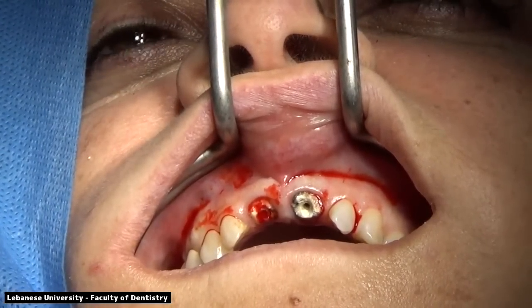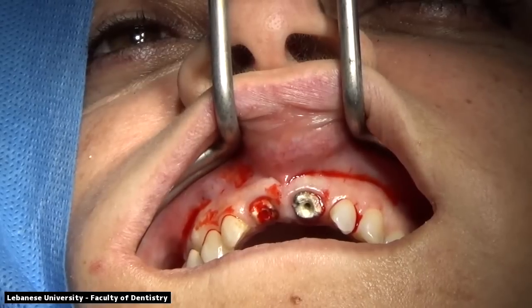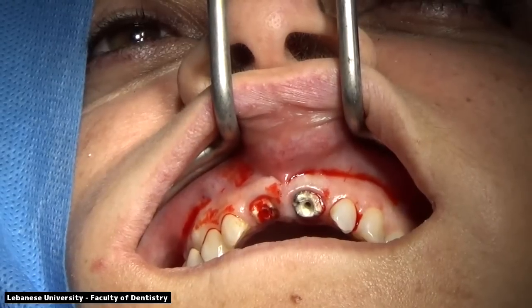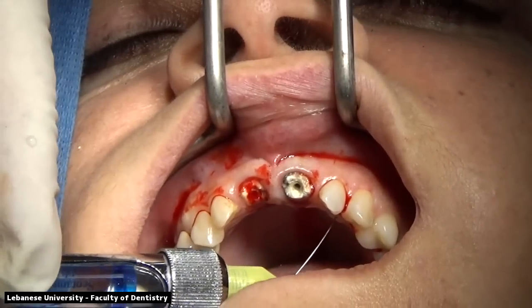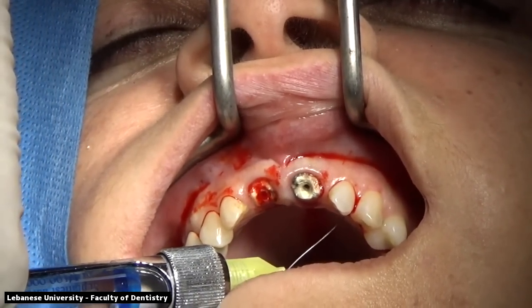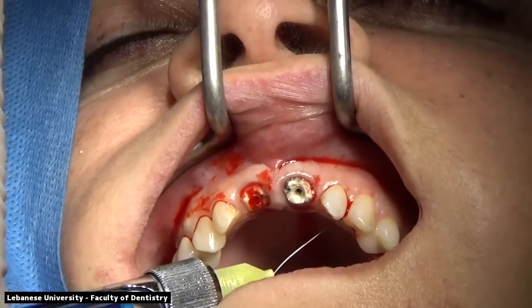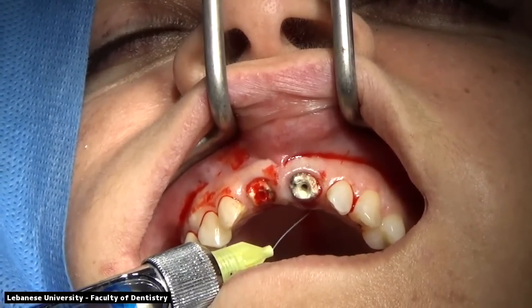Upon examination on the CBCT, we noticed that the buccal plates of bone were intact. There were no fenestrations or dehiscences present. We do not have any periapical infections or any radiolucencies present at the apices of the remaining roots. The palatal anesthesia and the nasopalatine is being given right now.